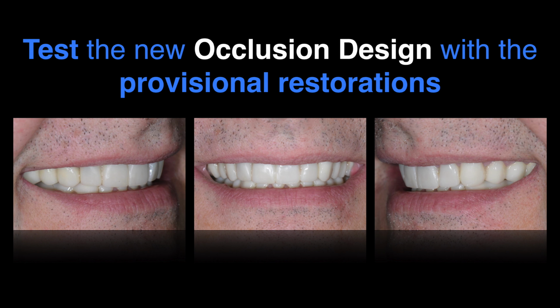Case three was also a ProTemp type of provisional, created from a shell of the diagnostic wax up, made in the mouth directly on the preps, removed, carved, and cemented. That's generally the go-to system that I use. I do show in my occlusion design program some indirect techniques, creating the provisionals on outside models of the preps. And that works great too. It's just not as efficient as using the preps themselves in the patient's mouth.